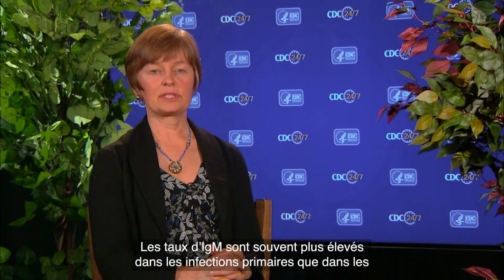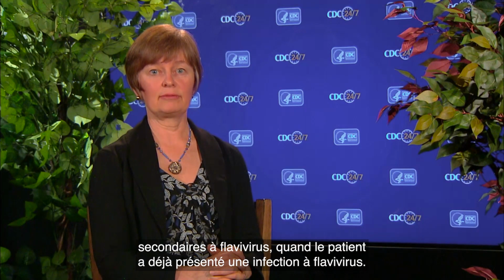Immunoglobulin M is typically the first antibody to be detected in acute primary Zika virus infections, and it persists for weeks to months or longer. IgM levels are generally higher in primary infections than in secondary Flavivirus infections, where the patient has experienced a previous Flavivirus infection. The Zika IgM ELISA is a qualitative assay.